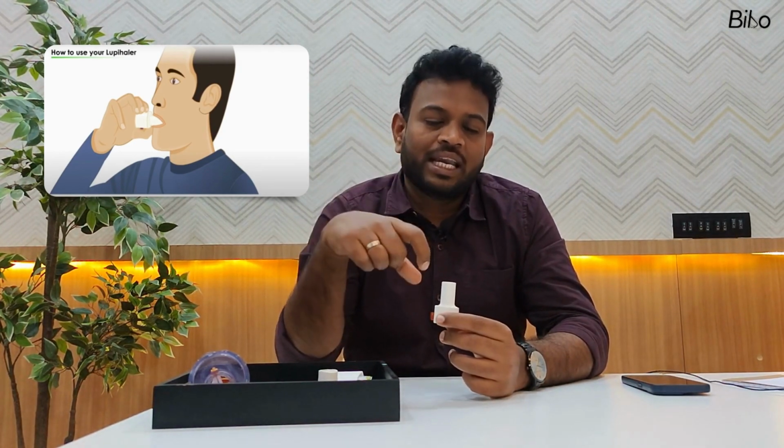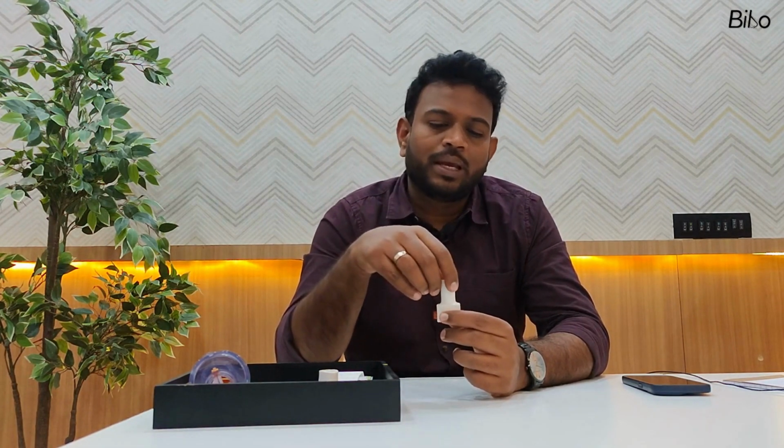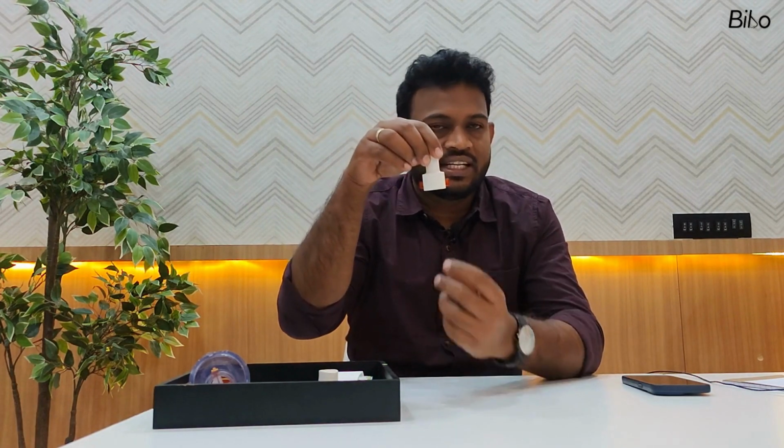Hold the breath for 10 seconds and then exhale through the nose, and then we have to repeat similarly. One capsule we have kept, so till the time the powder is emptied from the chamber, the patient will be inhaling. And we have a few other forms of devices where you will be able to see how much powder is left in the chamber. There are a few other brands which are transparent, where the patient can see how much powder is left. If you feel that the entire medicine is over, then one puff is enough. If you feel that some amount of drug is still left in the chamber, we have to repeat again.